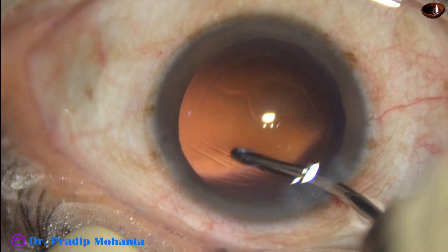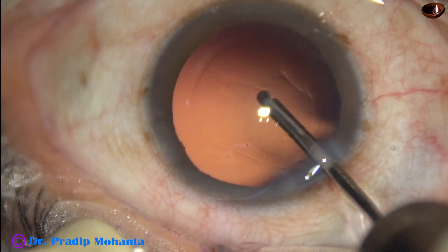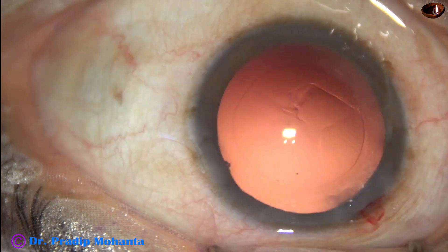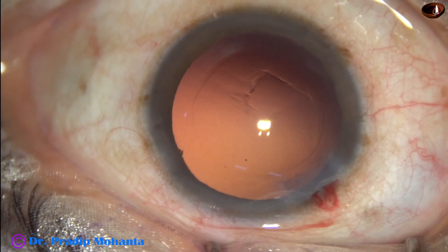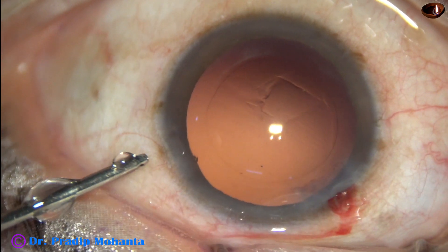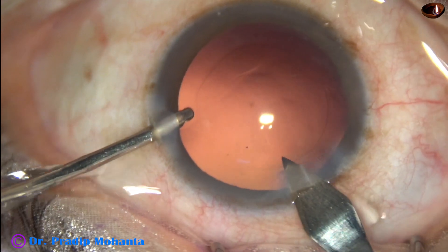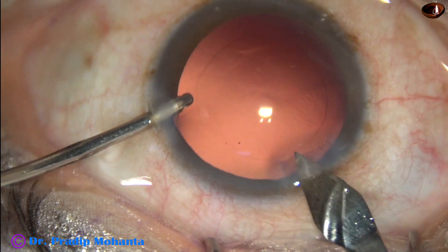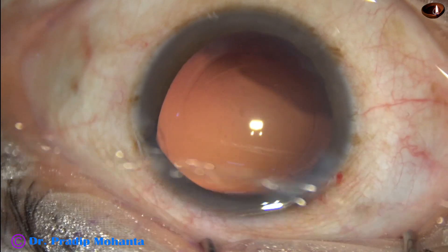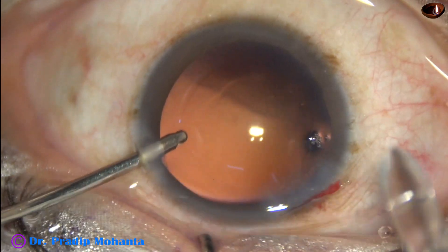In this case, we have selected a single-piece monofocal hydrophobic intraocular lens from Johnson and Johnson. It is the Sensar — a beautiful intraocular lens. I am using a B cartridge, so the main wound is enlarged by 0.1 or 0.2 millimeter to get the wound size of about 2.9 or 3.0 millimeter.